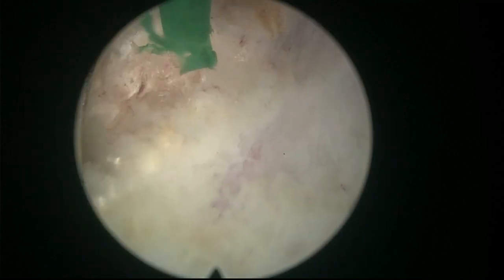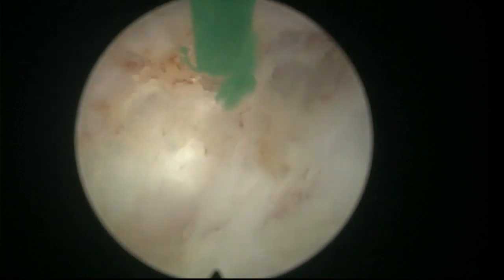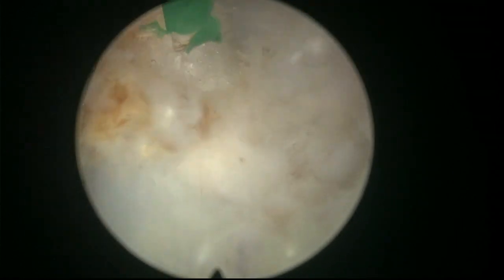I'm going to push the adenoma a little bit further up, lift it a little bit so I can expose this region. That's a little bit of adenoma maybe. We have to go that way. That's the plane we have to follow.